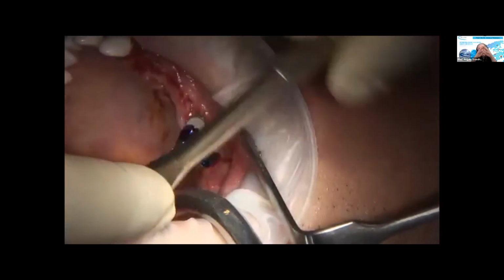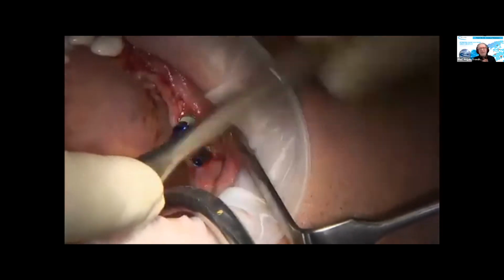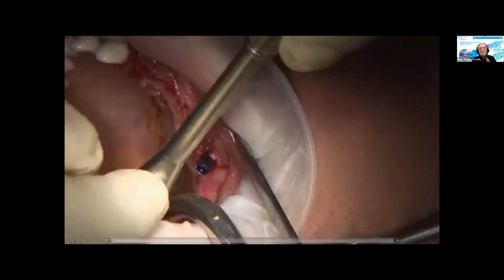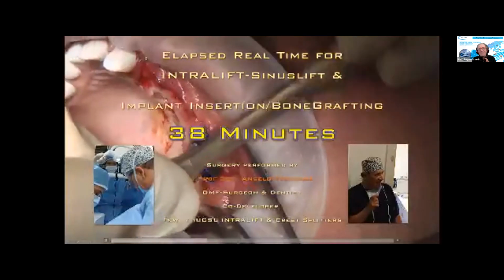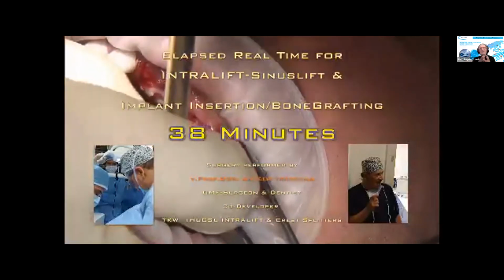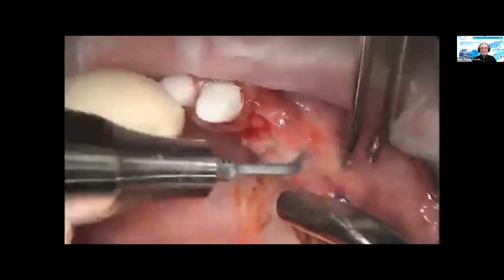And all this, we filled the entire sinus floor. You will see then in the results part, when we do the post-surgical CBCT investigation, all this, if there would not be the lateral atrophic alveolar crest, this would have been done by a single mesiodistal incision and a booklet flap. No detachment of the surrounding bone from the nurturing periosteum. And actually, in this case, in real time, it took 38 minutes. But you filled the entire sinus floor and you inserted simultaneously 2 implants, which then can be loaded approximately after 6 to 7 months.